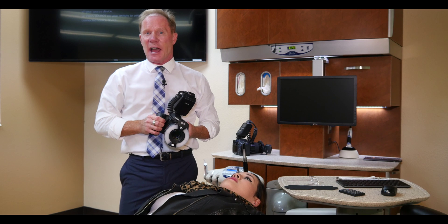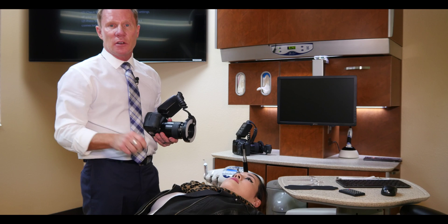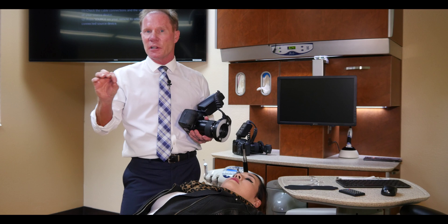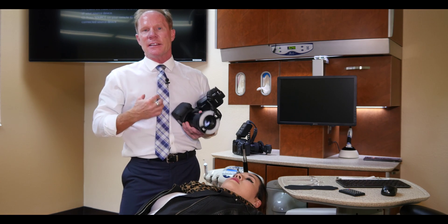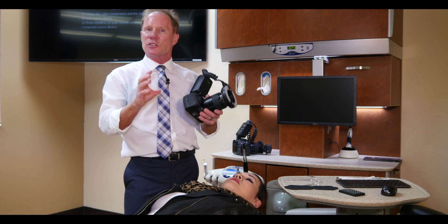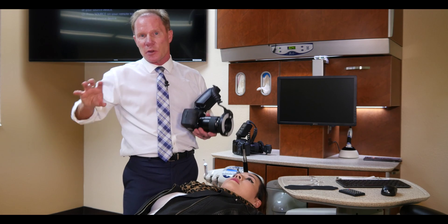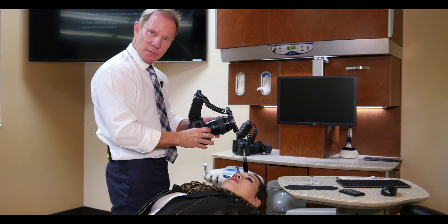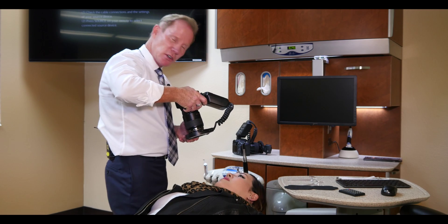Another picture I like to capture that not all dental photographers do is what I call a one-to-one close-up. If you look at Vogue, InStyle, or People magazines — lipstick ads — they have those big, beautiful close-up images of lips and teeth. It's a very sexy look, especially for someone like Marissa, and it's great for your website, Facebook, or print ads. So I'm going to set the camera to one, which is a one-to-one ratio. Go ahead and turn toward me — this is going to be a closer view, big smile.